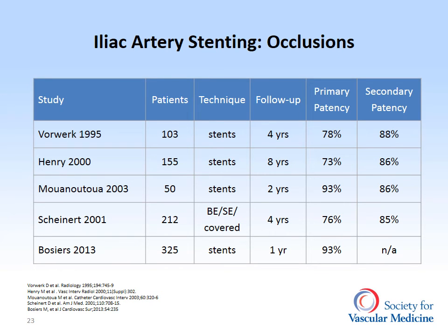Iliac artery stent patency across 5 studies. In these studies, 1-year patency was greater than 93%, 2-year patency over 90% as well, 4-year patency approaching 80%, and 8-year patency in one study above 70%.